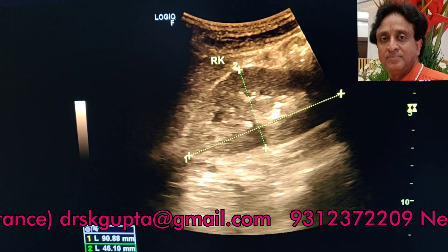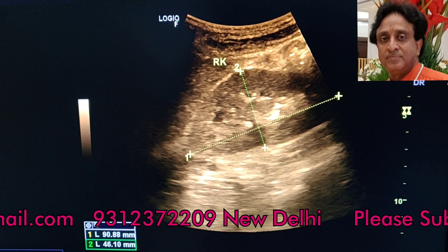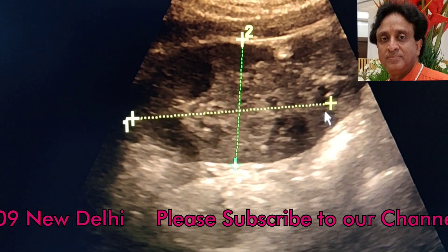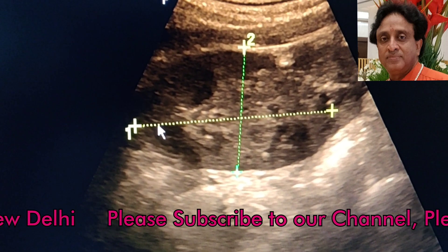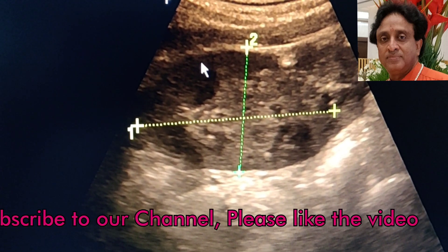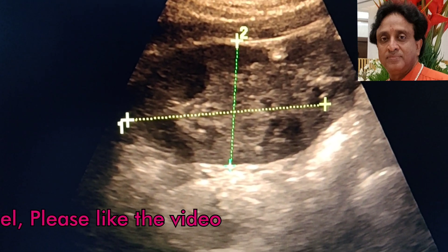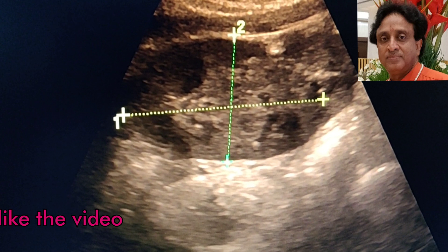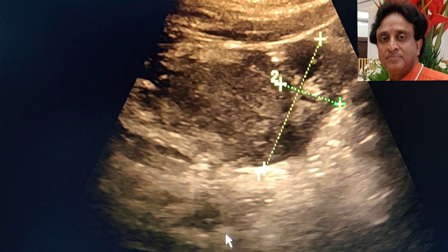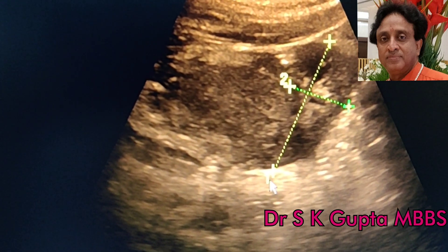The size of the right kidney was found to be 90 by 46 millimeters, which is normal. Now looking at the left side, the main left kidney measures nearly 87 by 53 millimeters in length and width, and the supernumerary kidney is smaller in size at 61 by 29 millimeters.